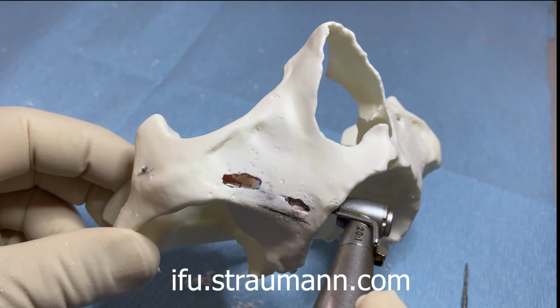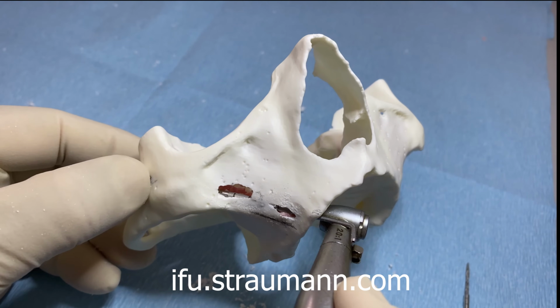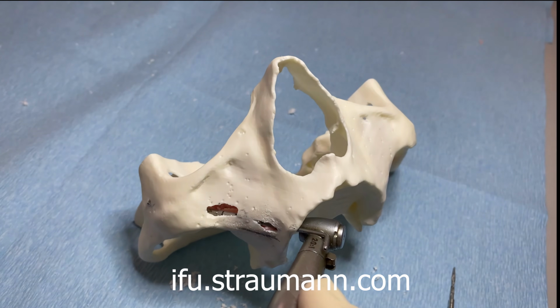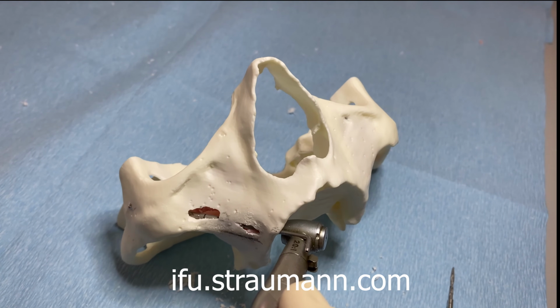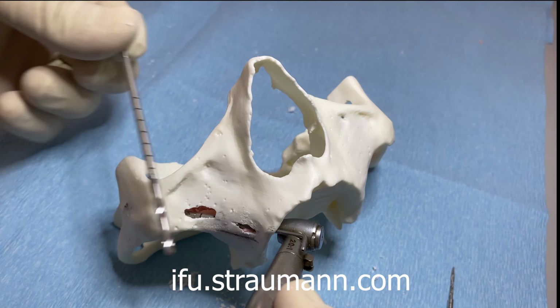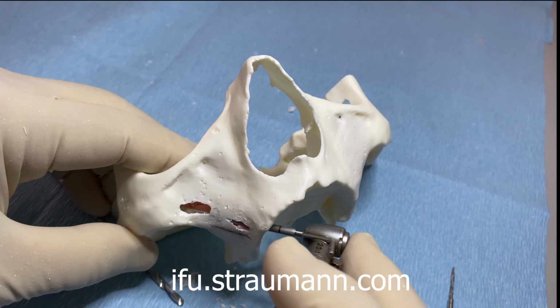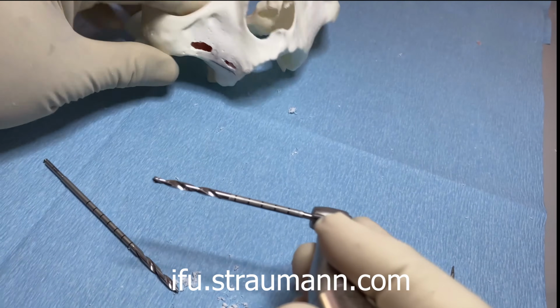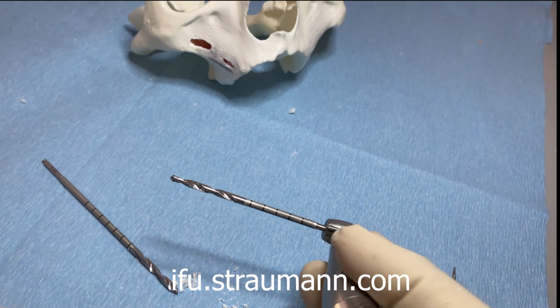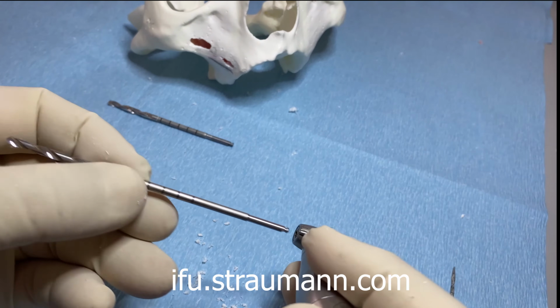If I need to go further, which I don't, but if I did need to go further, I could not. That is why there actually is another 2.9 millimeter drill with a longer shaft. Okay, so if I was to demonstrate right now, taking this out, exchanging the shorter drill for a longer drill.